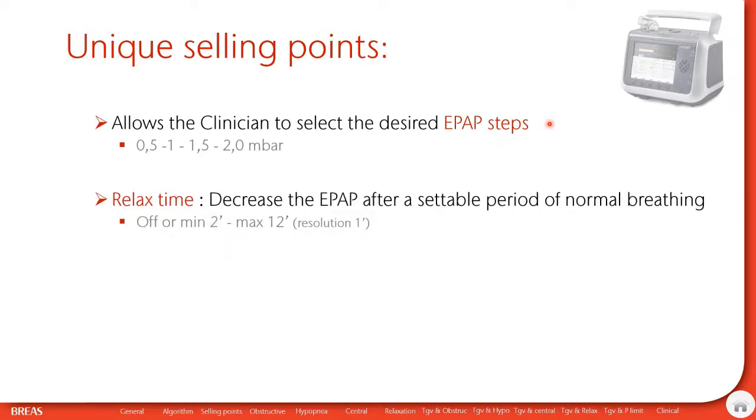The relax time, as said before, somewhere between 2 and 12 minutes, allows the clinician to also impact and select the desired period of normal breathing, after which the EPAP will decrease.